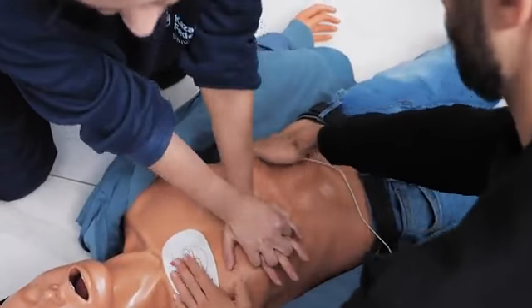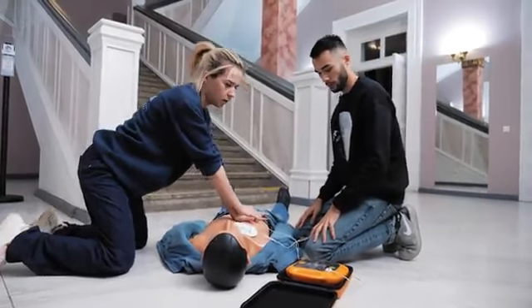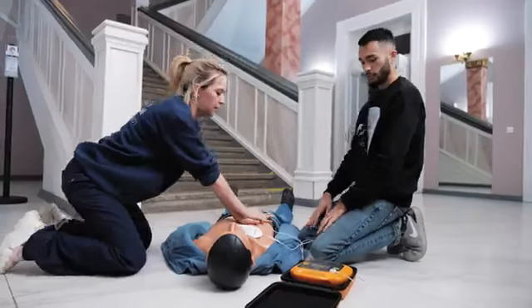Press pads firmly to patient's bare chest. Analyzing heart.